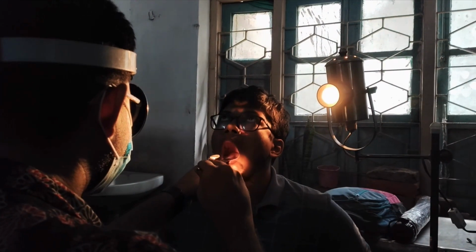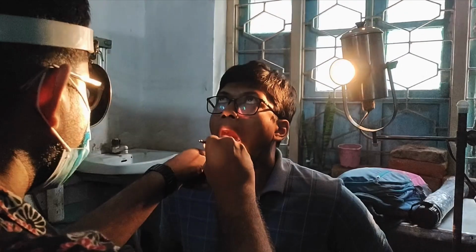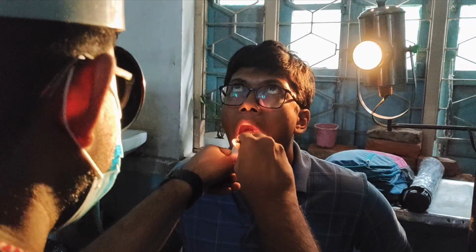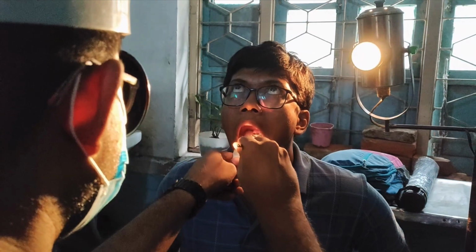Now coming to posterior rhinoscopy. Again, the light from the bull's lamp is reflecting via the head mirror onto the throat of the patient. You need a tongue depressor for this procedure. I'll depress the anterior 2/3 of the tongue like I said before. Then I'll introduce the PNS mirror. Again, this should be a preheated PNS mirror, by dipping it into boiled water and then drying it, so that the temperature is raised and there is no fogging of the mirror.